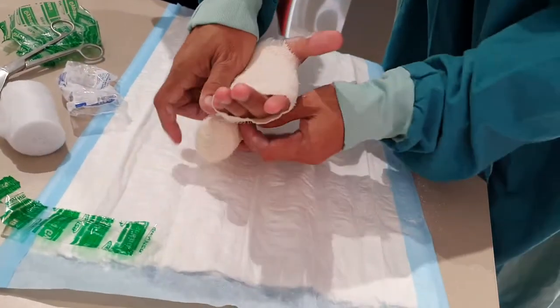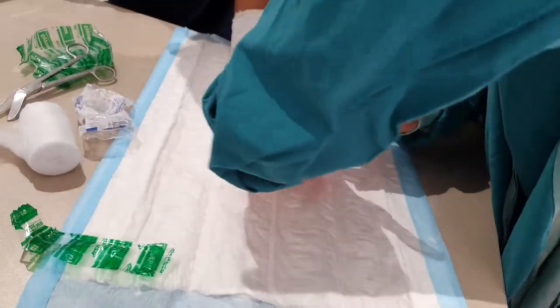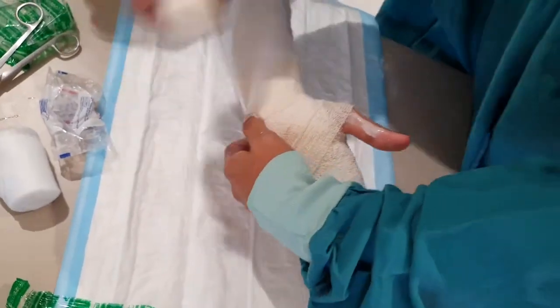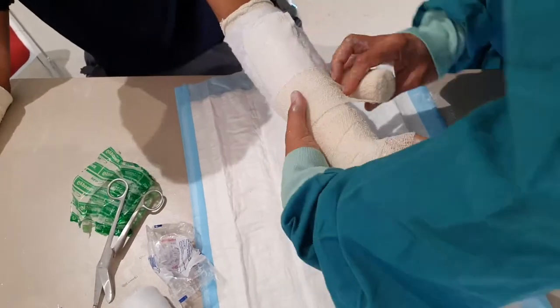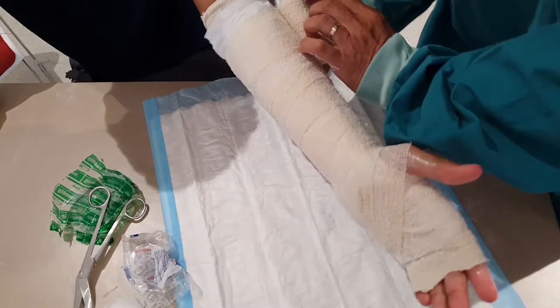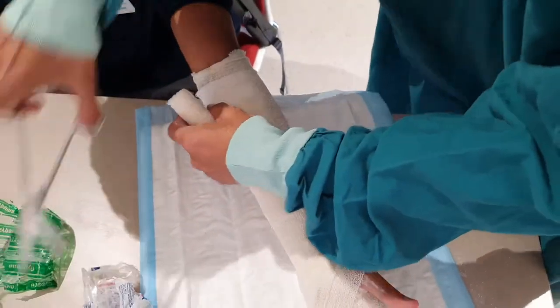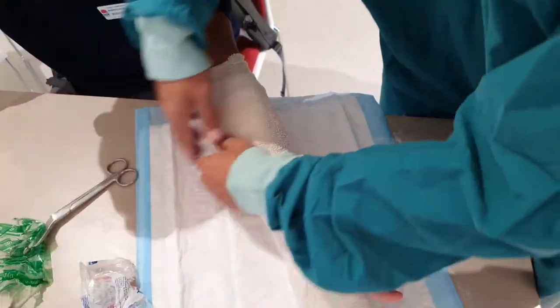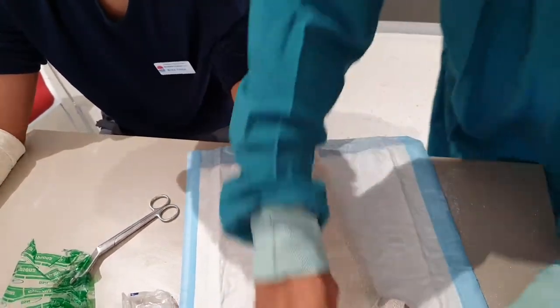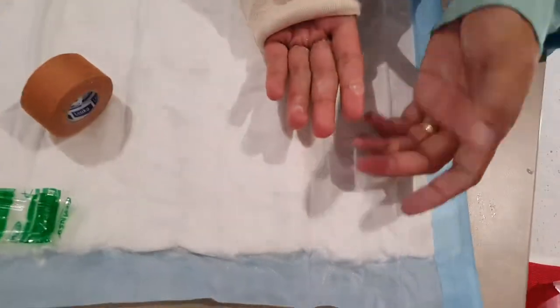It's really just bandaging at this point. Starting from the hand — I do like to bandage these a little bit firm. When you get a fracture, patients are in a bit of pain but I do like them to feel a bit of compression. Ideally I would have done circulation observations pre-plastering, and I'm certainly going to do some post-plastering. I'll tape that down — I'll just tuck it in for now.